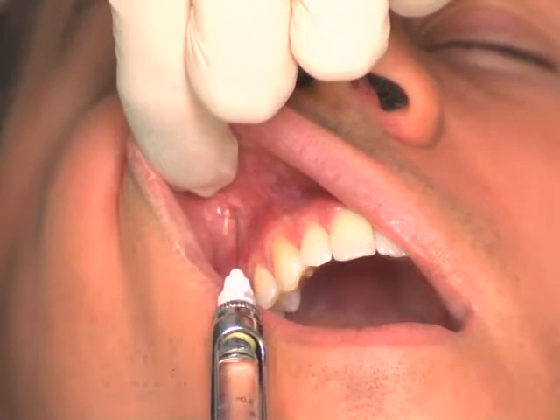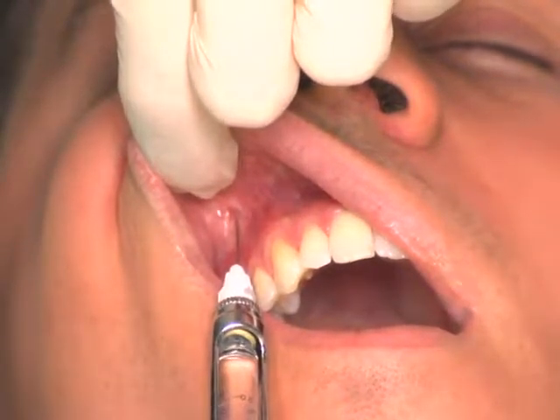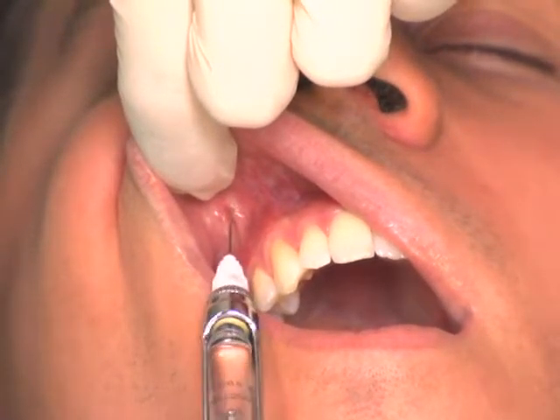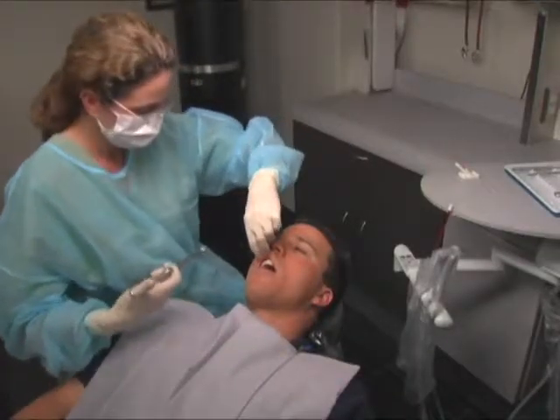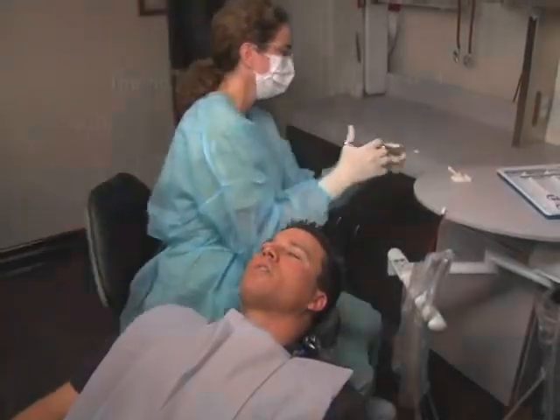Slowly deposit the local anesthetic solution and communicate with your patient: 'I'm doing this slowly so that it's more comfortable, but I'm not going to give you any more than you need.' Then slowly withdraw the syringe, cap the needle, and discard.